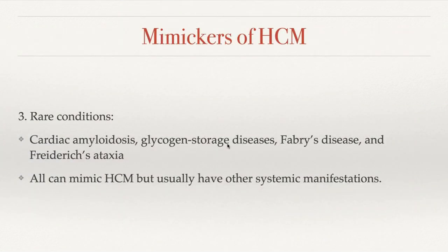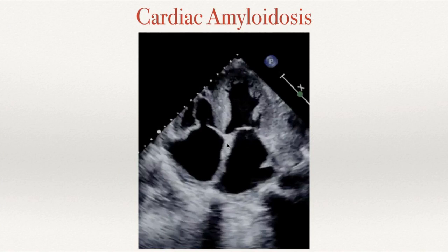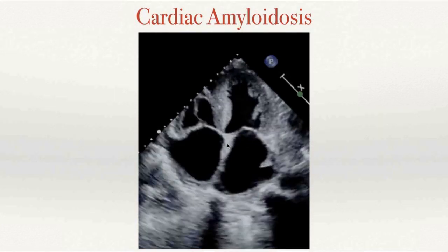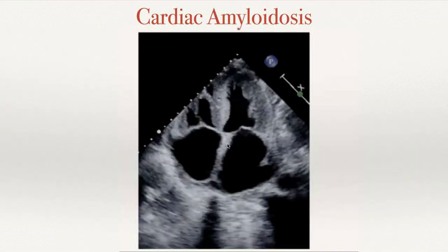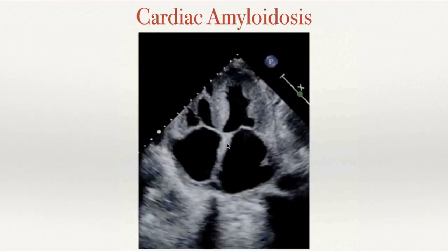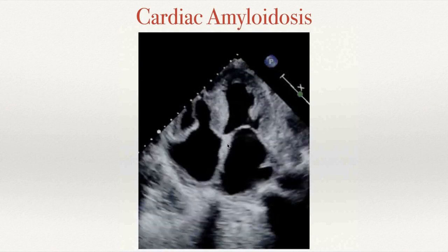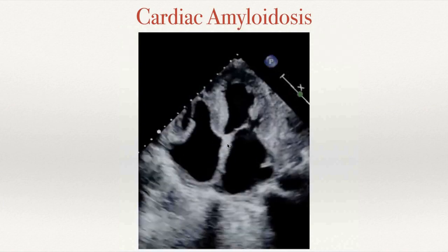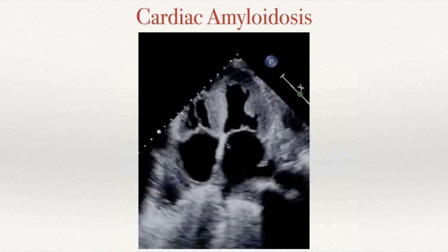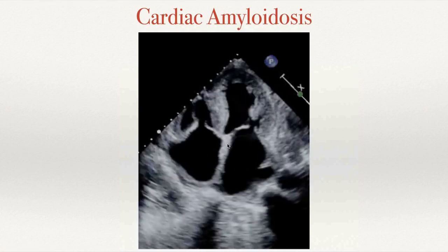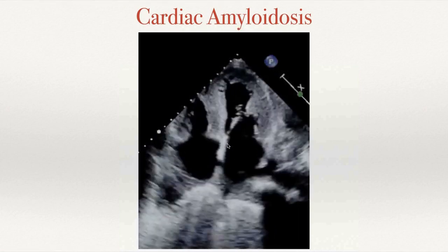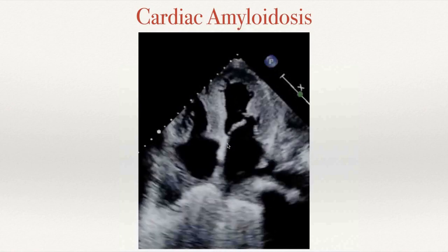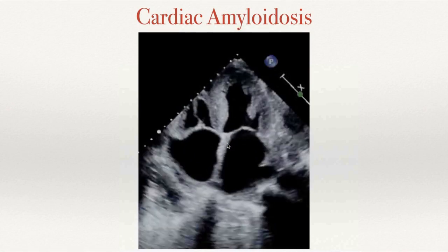Rare conditions that can mimic HCM include cardiac amyloidosis, glycogen storage diseases, Fabry's disease, and Friedreich's ataxia — all causing LV hypertrophy, but usually with other systemic manifestations that clue us into the diagnosis. A loop for a patient with cardiac amyloid shows concentric LVH usually described as having a speckling pattern, with the RV typically involved as well as biatrial enlargement.